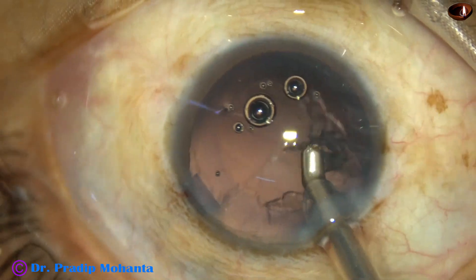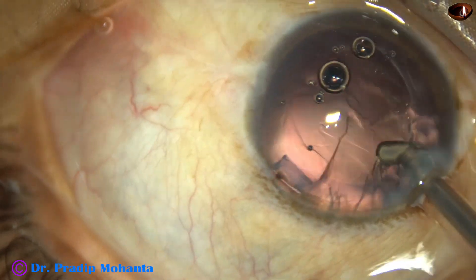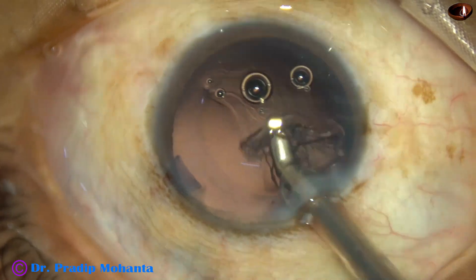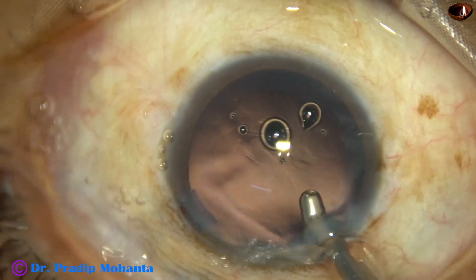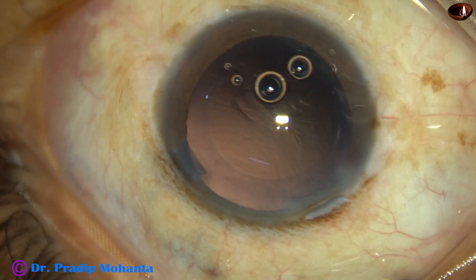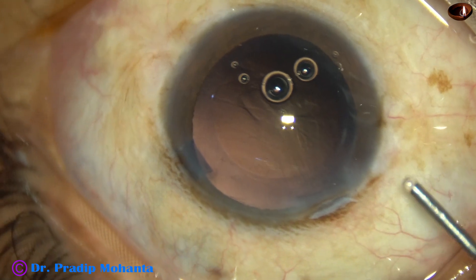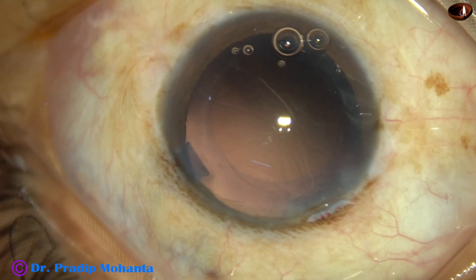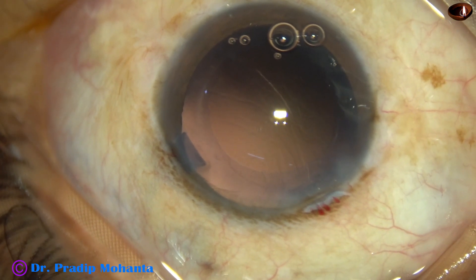The lower half is done. Come to the left side. And as I turn, the sub-incisional cortex also comes out. Now, there are some fibers — lens cells sticking to the posterior capsule just in front of the main wound. We must remove these fibers.